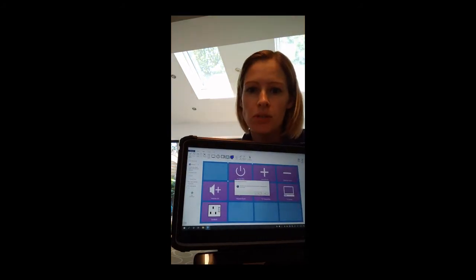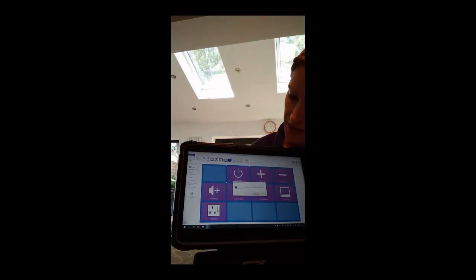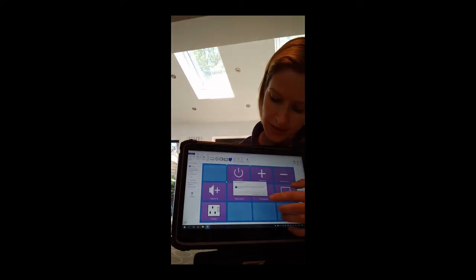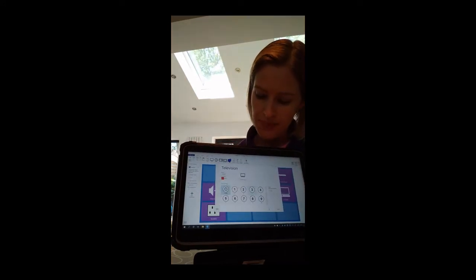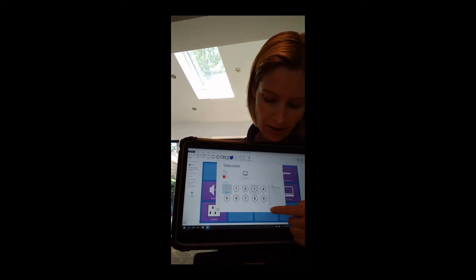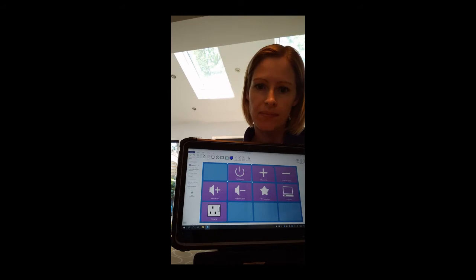The first time you do this within the Grid 3 software it will come up with a little message that says 'You have not yet added any television accessories. Do you want to do this now?' You need to click on Yes. It will come up with this screen — just go down to the bottom and select OK. You'll only need to do that once for each TV that you set up.